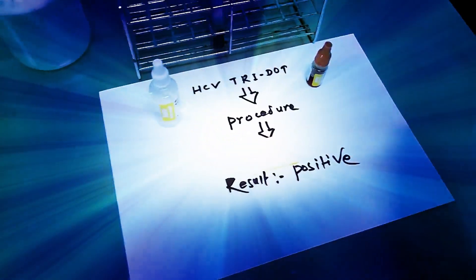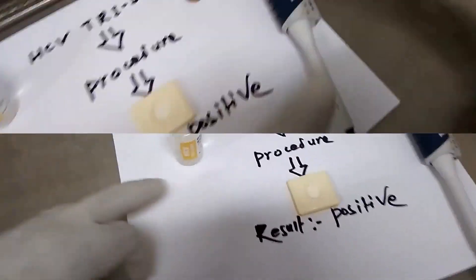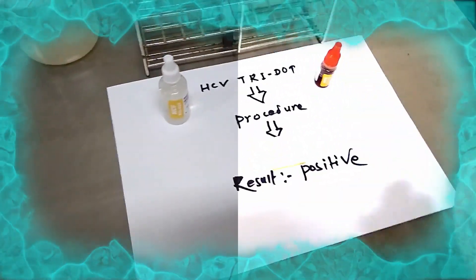Extra we need sample working hypochlorite solution for decontamination. In the place of dropper we can use micropipette tool.